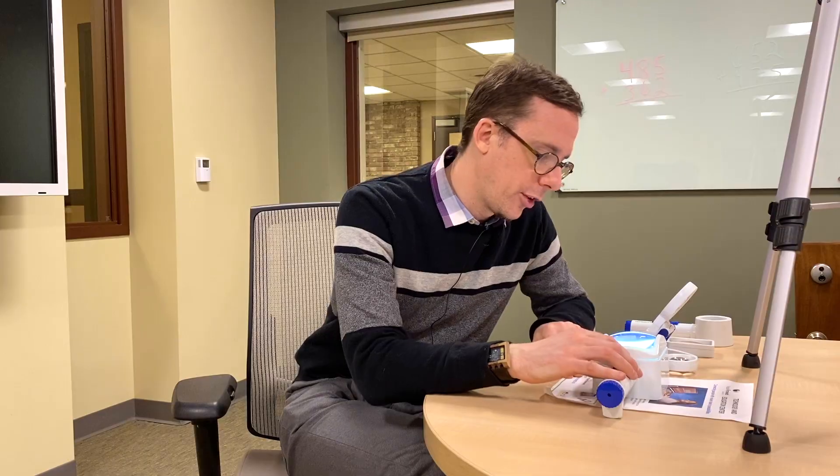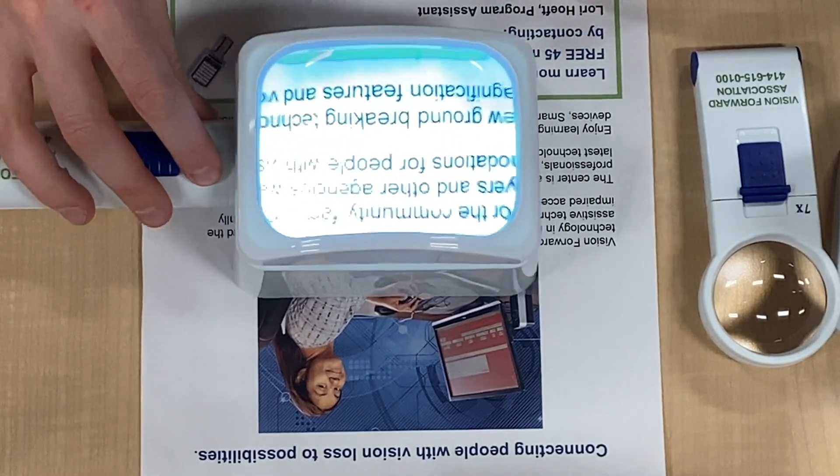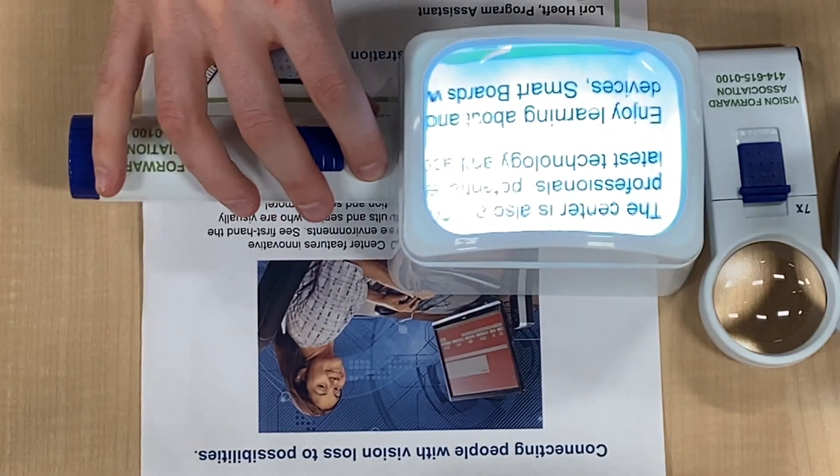Stand magnifiers can be very useful because you can just rest them on the table. If you have trouble holding a handheld magnifier still enough, or if you want to read for an extended period without your arms getting tired, a stand magnifier is a great solution. You rest it on the table and move it left to right and up and down as you read. They come in different powers, and the higher the power, the smaller the lens — so the less you'll see at any one time — but it's a good option for more extended reading.